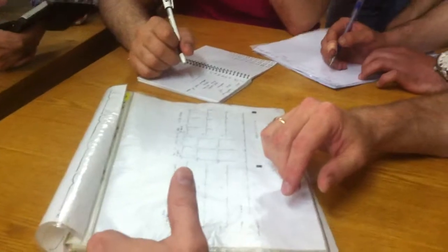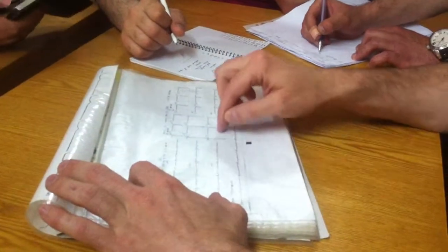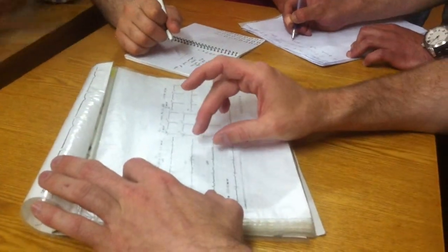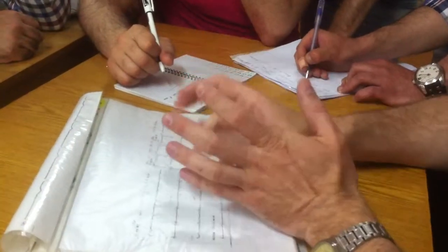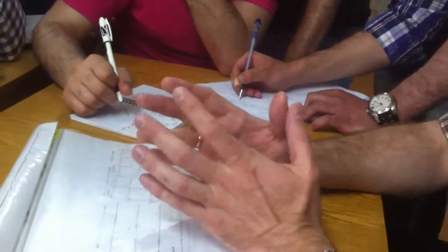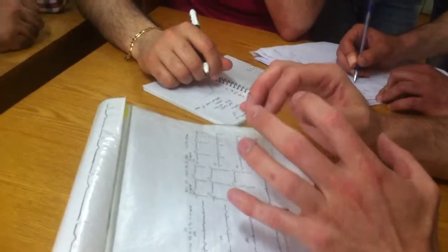Then lower, the rhythm from the AV node: absence of P wave, QRS complexes are narrow, and the RR interval is equal. It says the rhythm is from the AV node. And ventricular rhythm: absence of P wave and wide QRS complexes with abnormal shape, so it may be split sometimes.